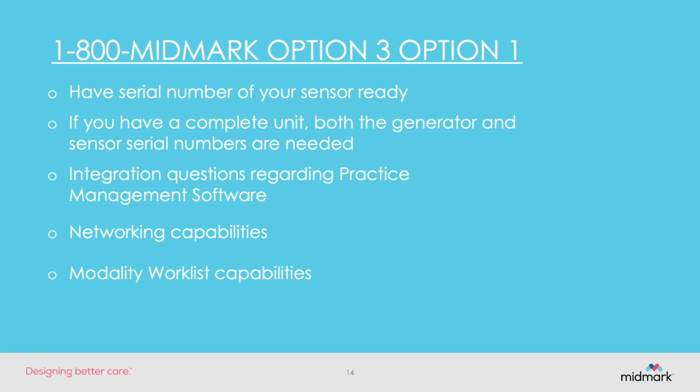Some of the other things that you can contact technical support for would be questions on integration with practice management software. I won't get into all of the details here because there are a lot of variables with the different practice management softwares. So when you give technical support a call, make sure you let them know which practice management software you have, and then we'll let you know what the capabilities are for integration. With most of them, there's some level of integration.